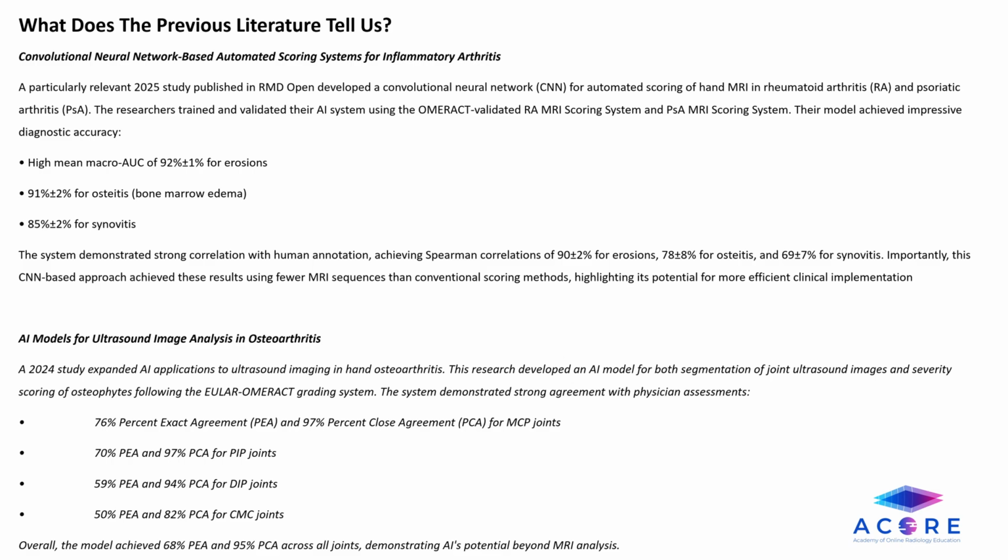And the system demonstrated strong correlation with human annotation, with impressive results all around for erosions, osteitis, and slightly less for synovitis. And this convolutional neural network-based approach achieved these results using fewer MRI sequences than conventional scoring methods, highlighting the potential for more efficient clinical implementation of AI when being used as an adjunct to a board-certified radiologist.